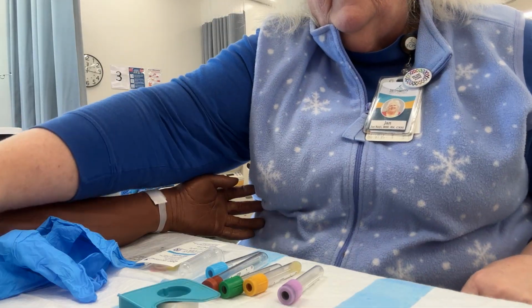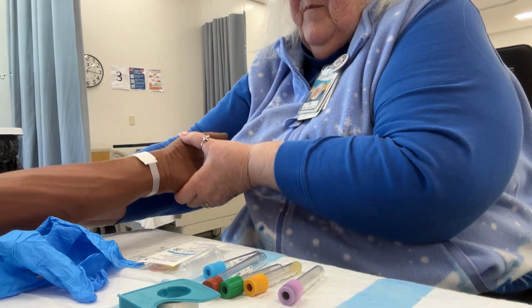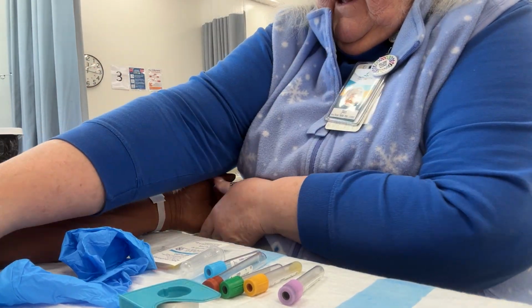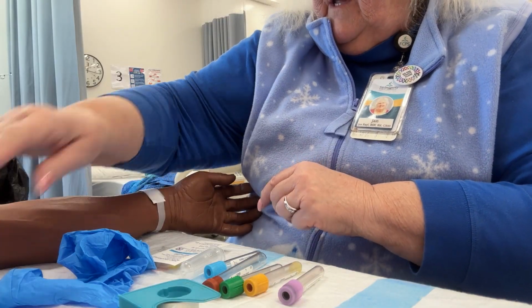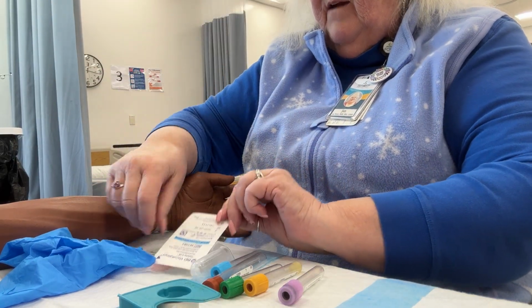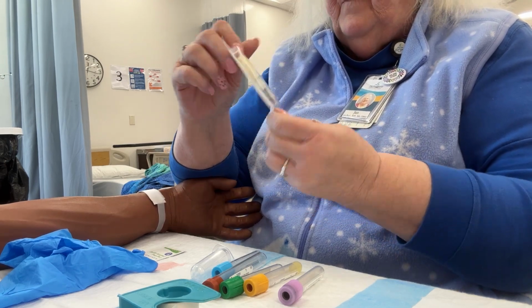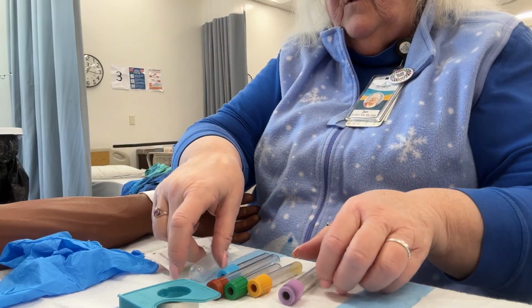So for my supplies, I have my tourniquet, I have my gloves in the size that I wear. I have, same as last time at the beginning, gloves, alcohol pad, and then you're going to have your needle, which in this particular case is a butterfly needle. Then you're going to have your needle holder, which is a Vacutainer holder.